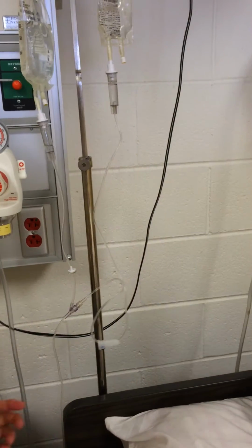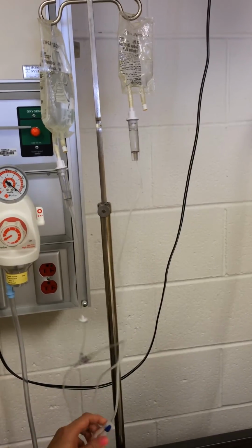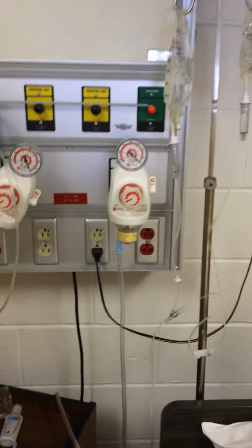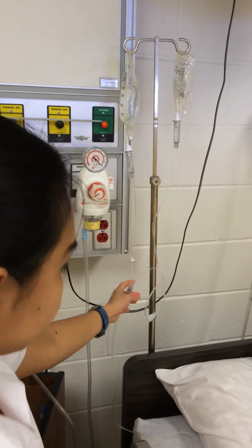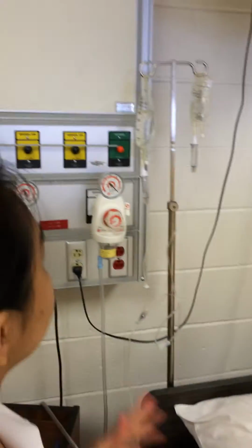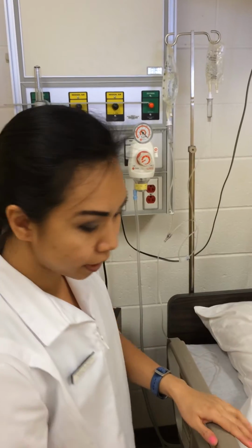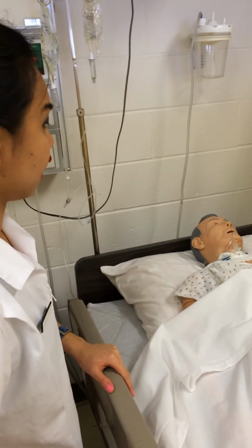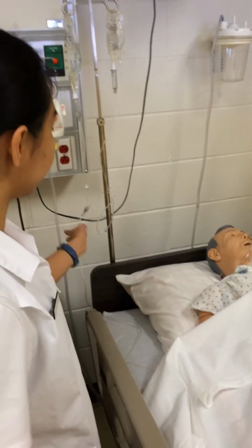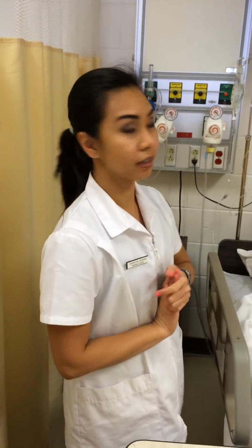Now I have already added the medicine to the primary IV. The physician order is 30 minutes. So I will make sure the patient is comfortable, and I lower the bed down, and the call bell is in reach. After those 30 minutes, I'll come back to remove the medication.